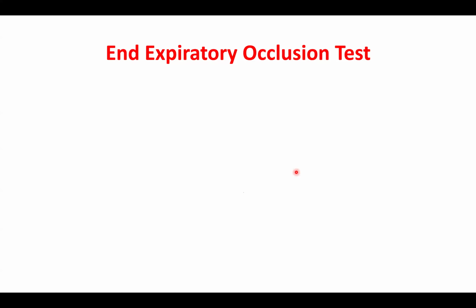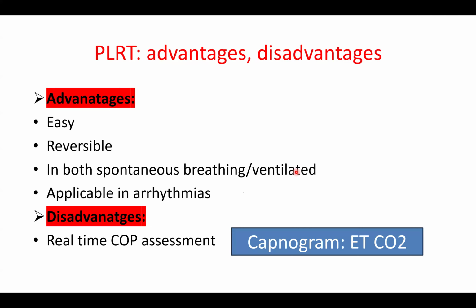Sorry, because the pulse pressure variability is appearing on the arterial line tracing. Yes, it can appear, but you cannot measure it. If you don't have a PICO monitor, you cannot analyze it as a number. You can measure it as a percentage, how much variation. I think it's now coming in new monitors as a fixed parameter.